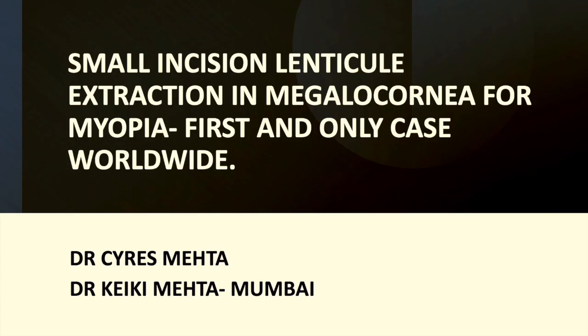We would like to share with you this video about small incision lenticule extraction in megalocornea for myopia. This is the first and only case worldwide.